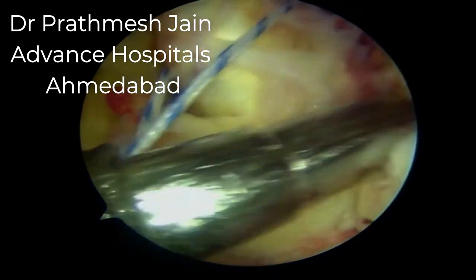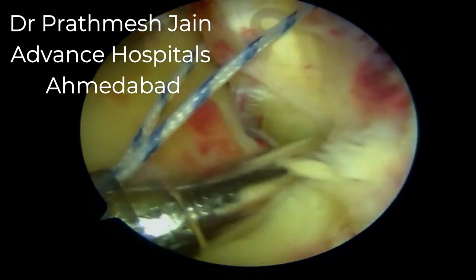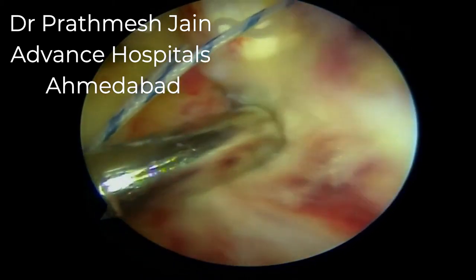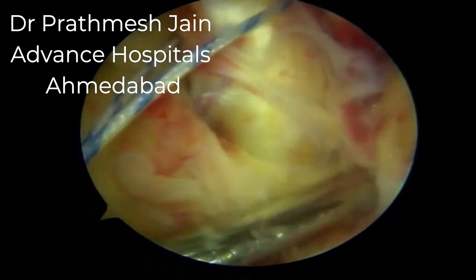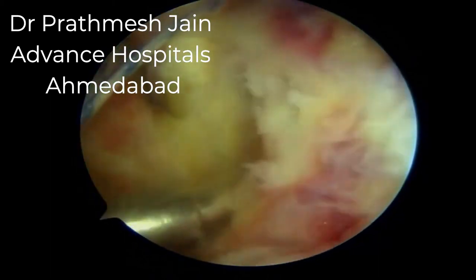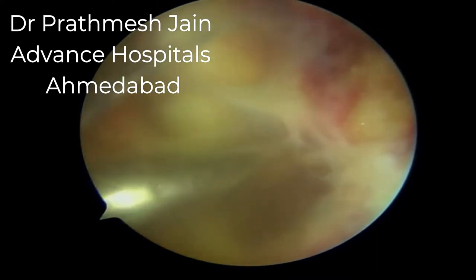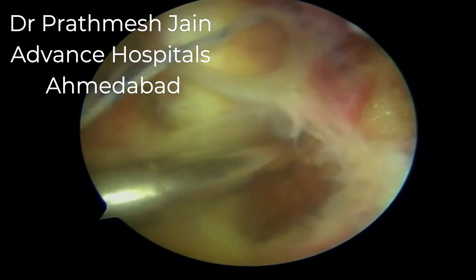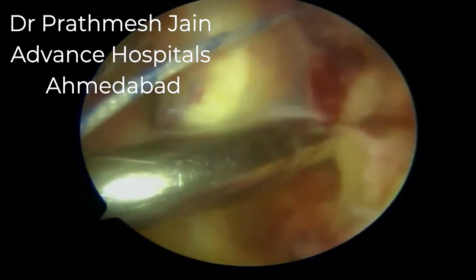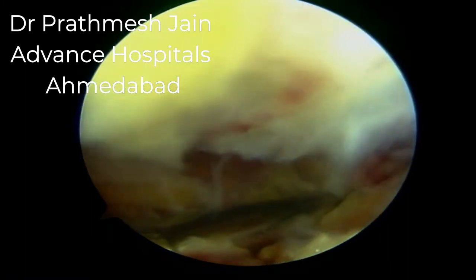We insert our camera into the high posterior medial portal and can now see the knee from behind. We can see that the PCL is lax, and this is a good time to perform careful dissection between the PCL and the capsule to expose the PCL avulsion fragment. The PCL avulsion fragment needs to be dissected elegantly, starting from the medial side and going to the lateral side.